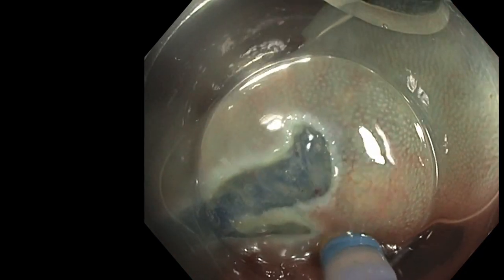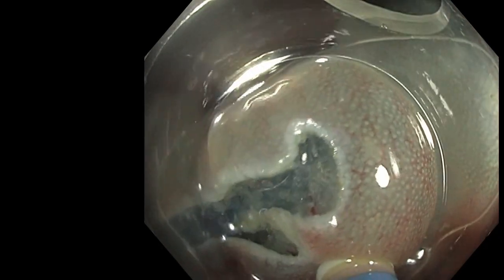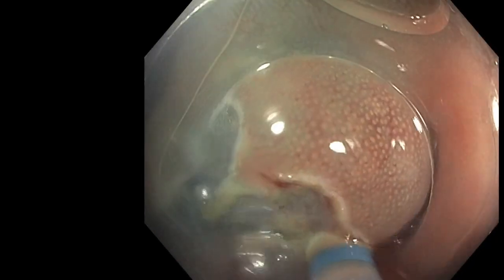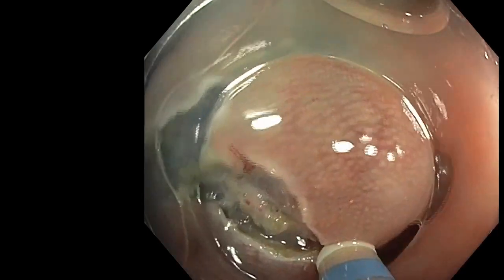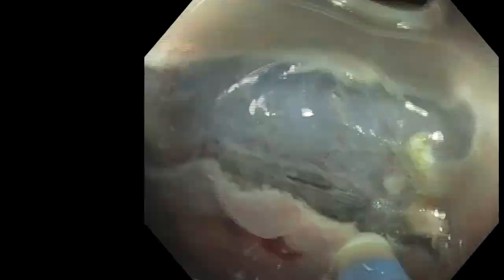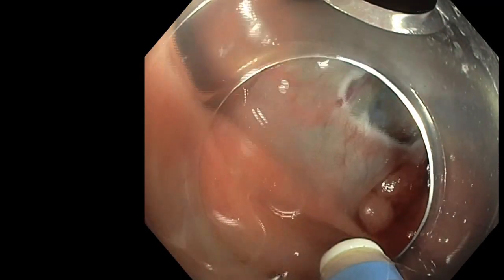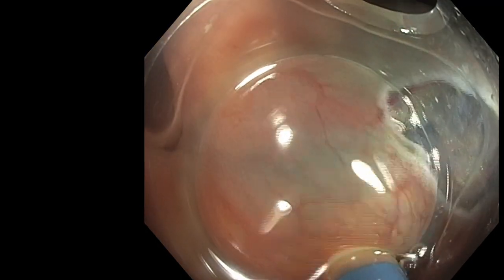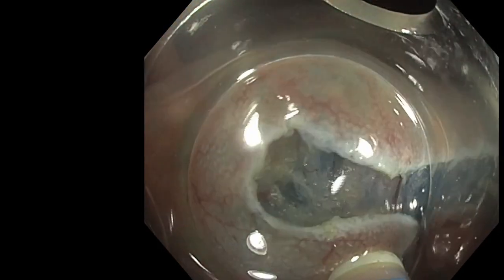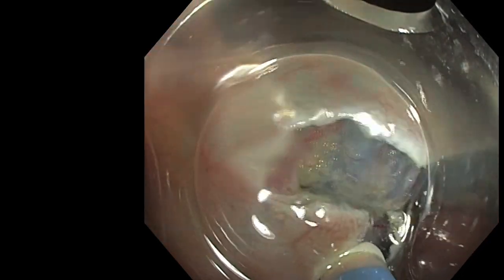Here it was not so easy because we were close to a second diverticula, so it was quite challenging to have a large margin on the right side of the lesion. So we had to do it very slowly, trying to go on this area, which has a very shallow submucosa compared to the conventional one we can have in the colon. And finally, I prefer to leave it for the end, doing the oral access on the left side and later on the anal edge of the lesion.